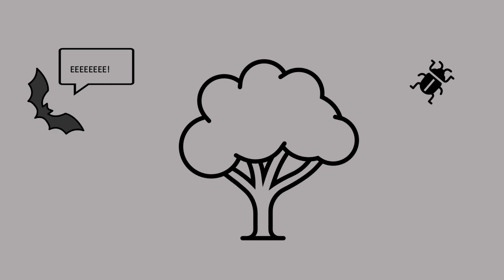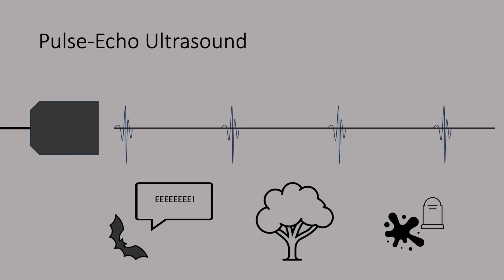So imagine a bat that instead of just emitting a little chirp and then being silent and listening, what if they were continuously just screaming, "Ee!" and flying through the sky? They'd have no way of knowing where they were going, right? They wouldn't hear any of those echoes that were coming back. So instead of getting a nice juicy beetle for dinner, they'd instead get splattered against the oak tree I planted in my backyard. And that would not be super fun. So the same thing happens with ultrasound.